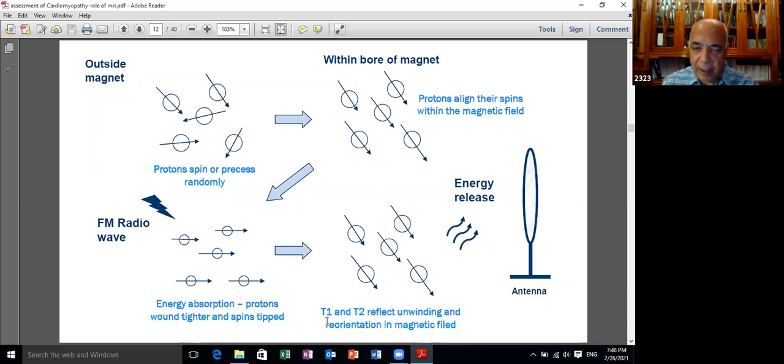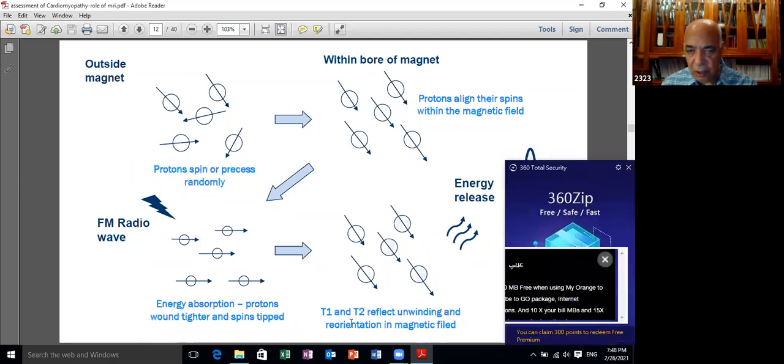On the other hand, anything which lengthens the duration or the time of T2 is going to give a bright picture. What is going to lengthen the time of T2 is water. So if you have inflammation, if you have acute recent myocardial infarction, water is there because of increased capillary permeability under these circumstances. It elongates T2 and produces a bright picture. So they are opposite to each other. If you shorten T1, you get a bright picture. If you lengthen T2, you get a bright picture. So remember that T1 and T2 are different characteristics of the tissues.